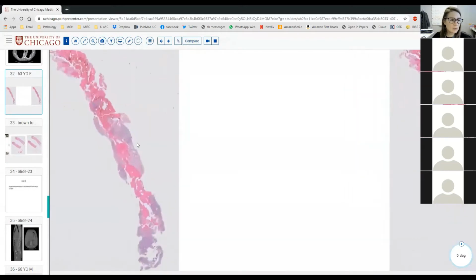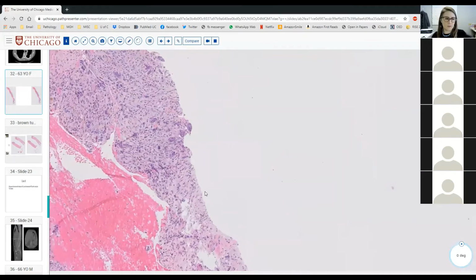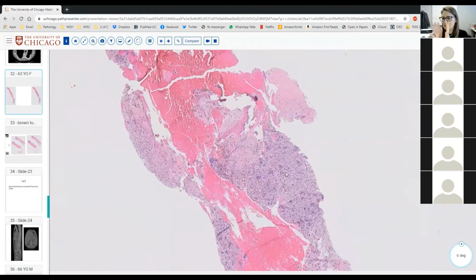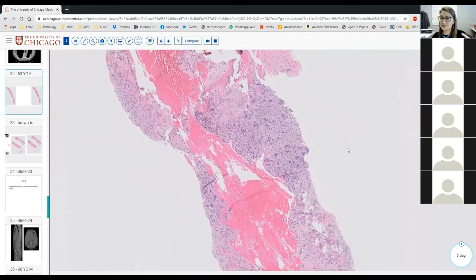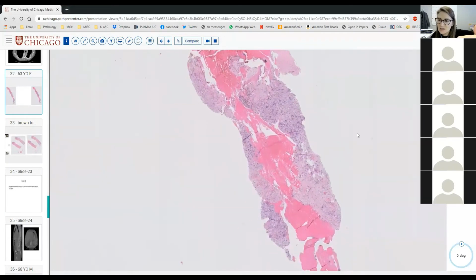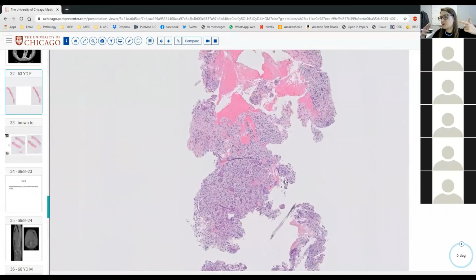But fibrous dysplasia is a fibroosseous lesion, right? So you should see osseous, you should see bone, and you should see very monotonous intervening fibrous tissue between the bone without giant cells. The only time you're going to see giant cells and blood lakes in fibrous dysplasia is if you have secondary ABC change. And if you have that, you would want to see some evidence of fibrous dysplasia in the background, right? Otherwise, you're never going to make a diagnosis either way.